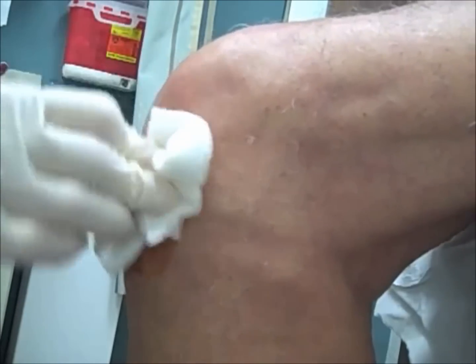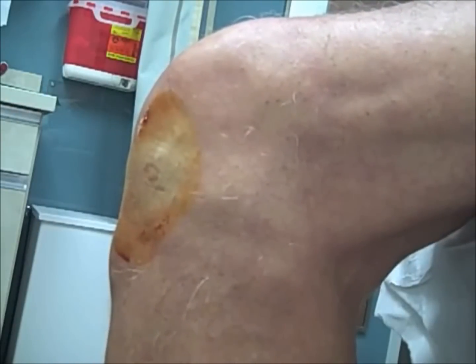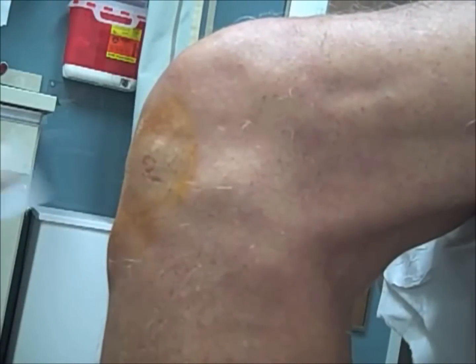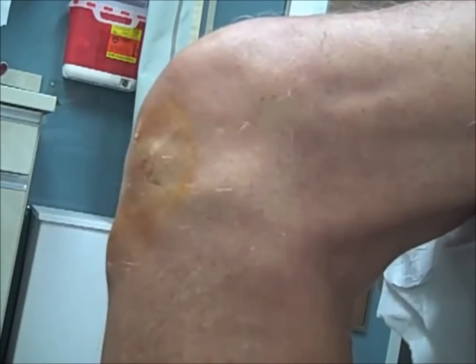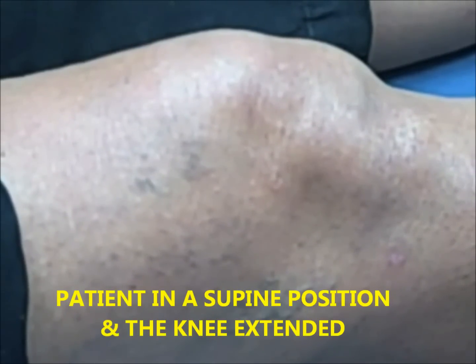We apply a little pressure after the medicine is injected, and we'll clean off the excess betadine and apply a Band-Aid. The patient is also given post-injection care instructions, and we'll see him in 1 week for the third injection of visco supplementation.